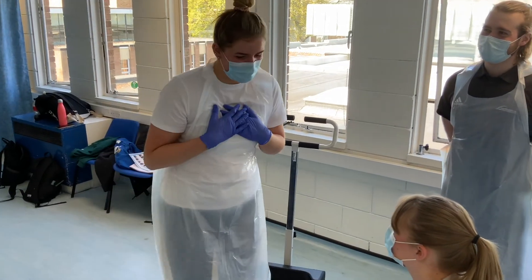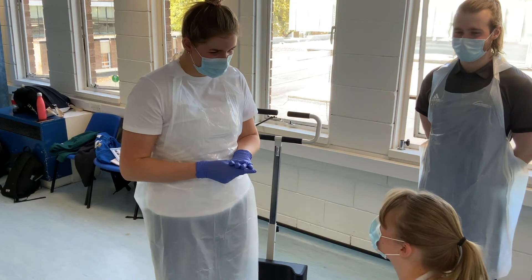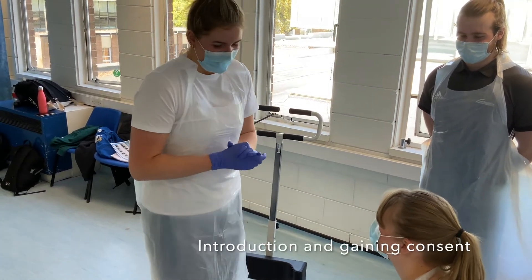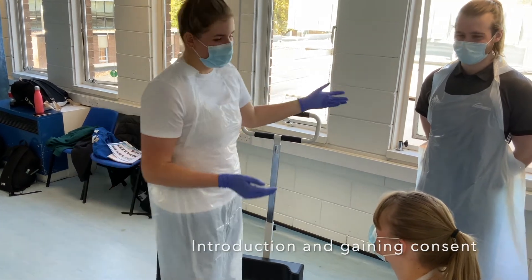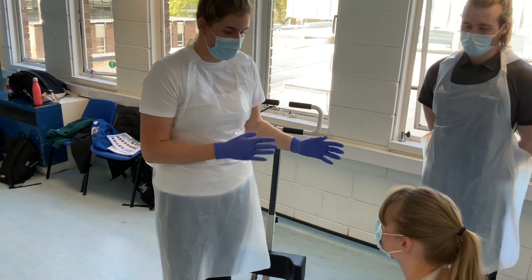Hello, my name is Sophie and today I'm going to move you from the bed to the chair. How are you today? Good, thank you. And what's your name? Lily. Okay, so this is my assistant David, and he's going to assist you throughout the movement to make sure you don't fall and he'll be there to support you.